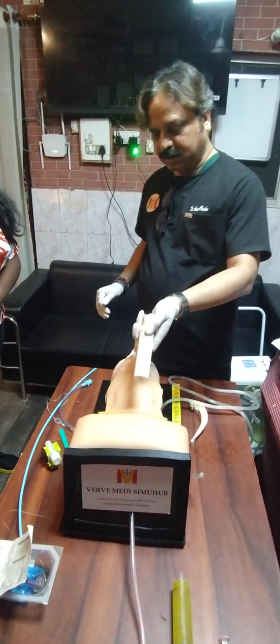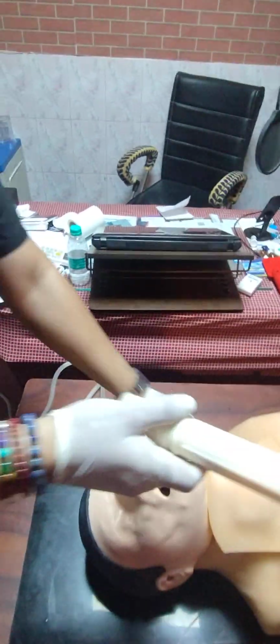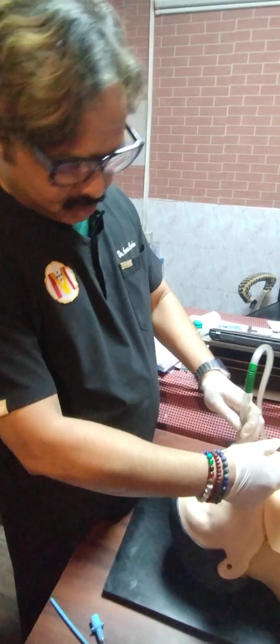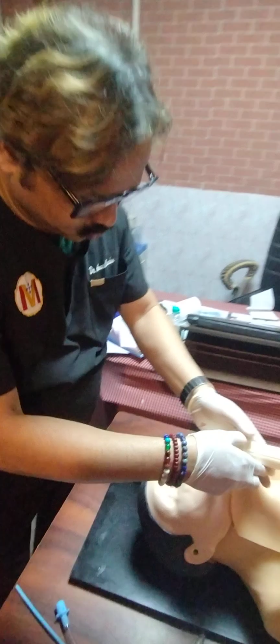I'll come to this side. So when I do this, first we will have to introduce the suction catheter. Okay. So now I don't see anything to suction. So now if I show you the inside view, on the side, properly, look.